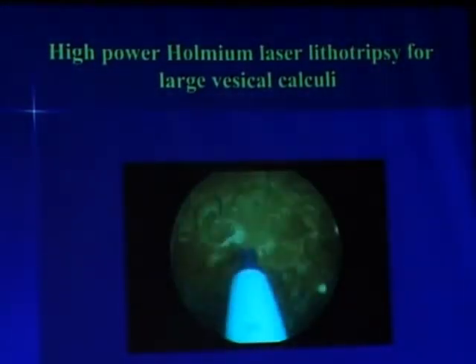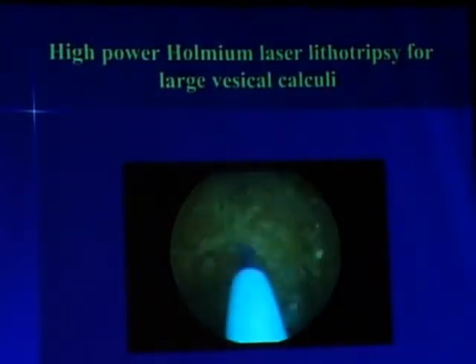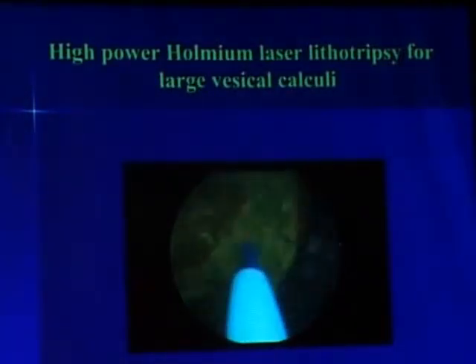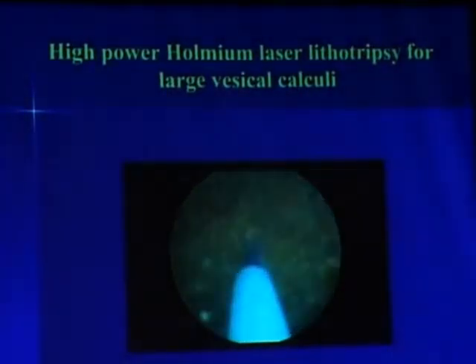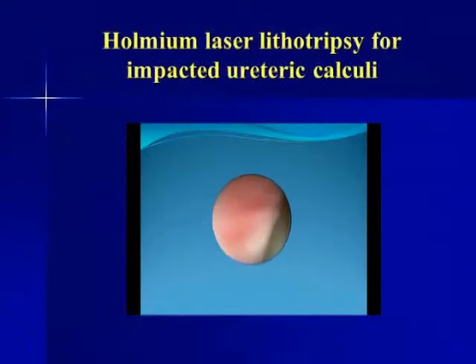And at the end of 20-30 minutes, this 4 cm stone will be converted into fine dust, which will settle in the bladder and will easily come out. So we don't spend a lot of time removing the fragments. The mucosa appears quite normal at the end of the procedure.